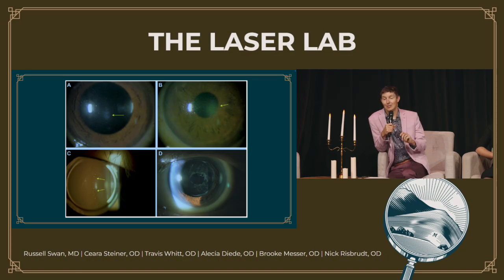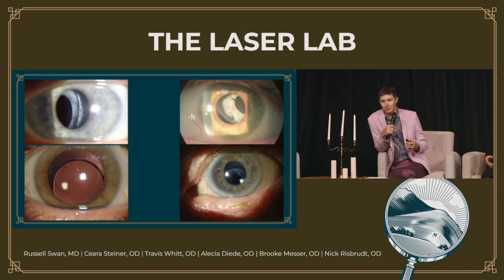The good news is this, like an IOL pit, looks very visually surprising at first, but will usually just fade with time and not cause any issues. In the top right photo, if it's really anterior where the energy was delivered, they could even have some epi stain or uptake if it were to happen. Interesting. So no YAGging the cornea.